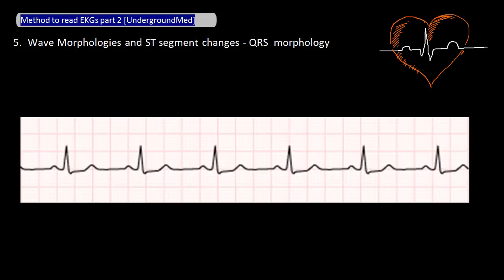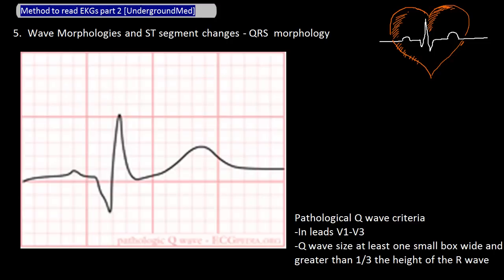After evaluating the morphology of the P waves, look at the QRS complexes in all 12 leads. If the patient does have a QRS complex, are there Q waves? In this case, there is no Q wave, which is normal. That means that the first wave in this QRS complex is an R wave. If the patient does have a Q wave, as shown here, how do you know when it's pathologic?